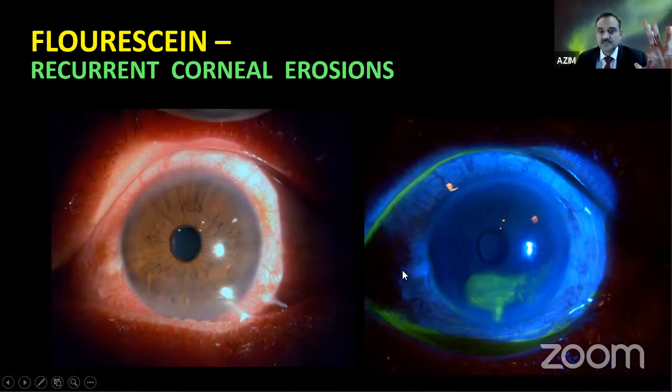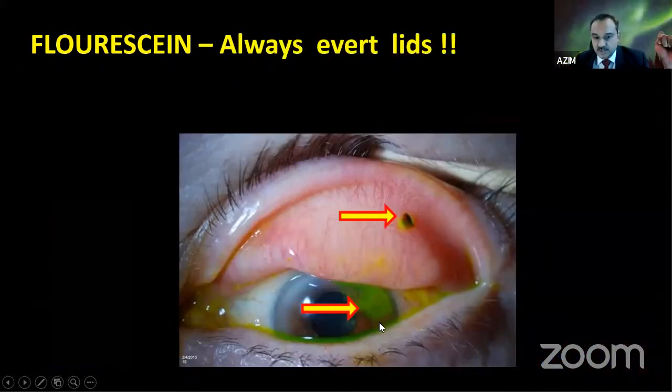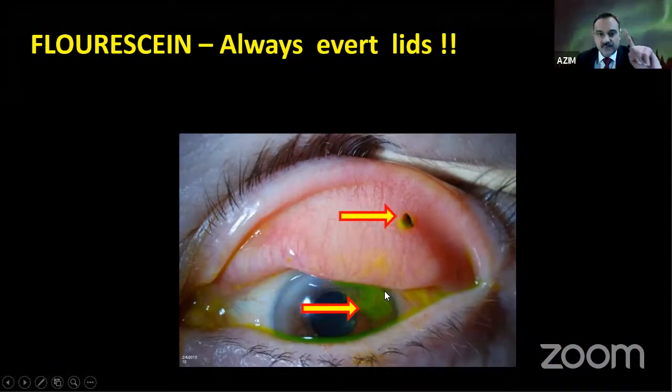Another point, remember this patient, any patient seeing an isolated abrasion, complaining of foreign body, please remember to evert the lid. This is a subtarsal foreign body here, which has been causing scratching here, causing an abrasion there. So remember always, no examination is complete without everting the lid.